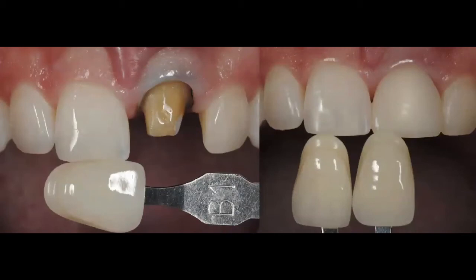Now, I am using the Vita shade tab, and I use two different types of shade tabs. I use the Vita Classic shade tab, and I use the 3D Master. And I use them because this is what the majority of us have in our practices, and what the majority of us use. And I lecture and I teach a lot, so I want to use what everybody's using, because I want to make sure that I can share with you information that you can use tomorrow in your practice. So we know that the lightest Vita Classic shade tab that we have is B1.